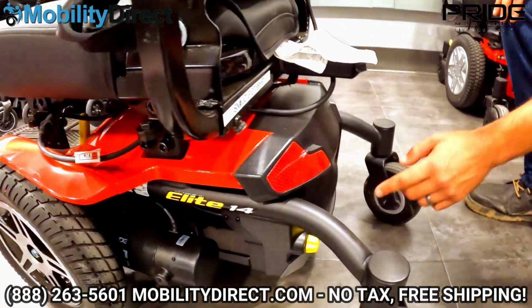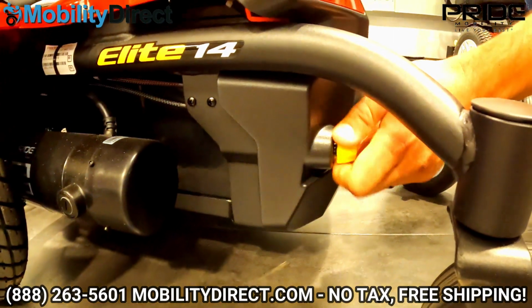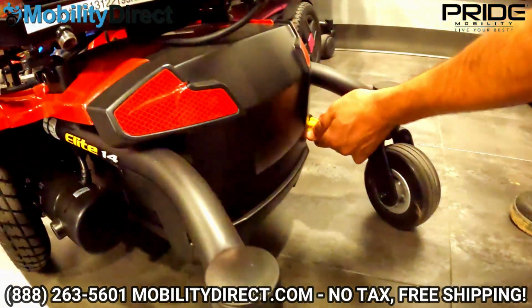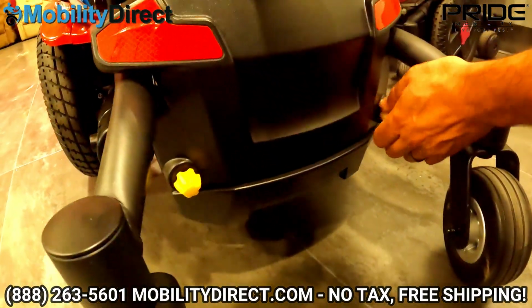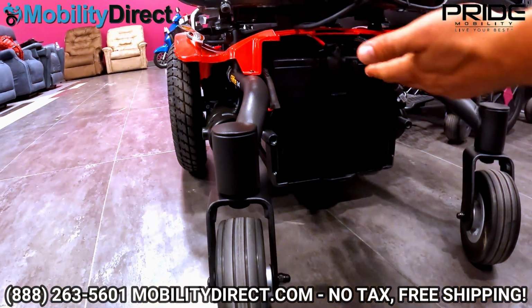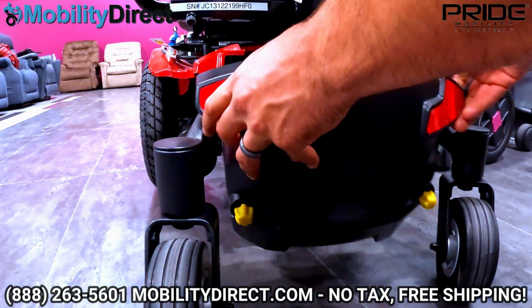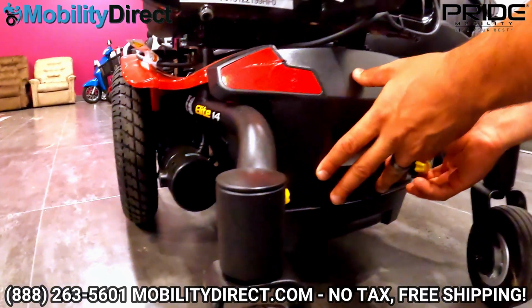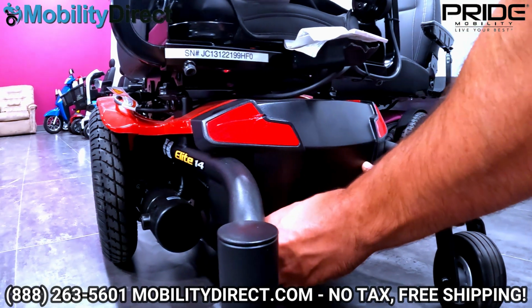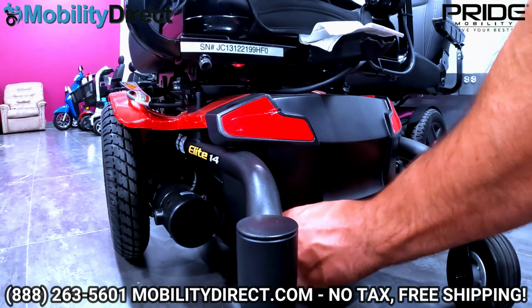And if you look at these yellow hand screws, these are for the technicians. It's very service friendly. Basically, you don't need any tools. You take these screws, you loosen them all the way, and that's how you're going to access the battery compartment. So when you're ready to change your batteries, just unstrap them here, pull the batteries out, and you can replace your batteries very easily. You actually don't even need to take the seat off. Most models you have to take the seat off, but the seat's pretty heavy. So if you have someone that can help you change the batteries, you really don't need a technician to do so. You just take this cover off, slide the batteries out. It has two 12-volt batteries.